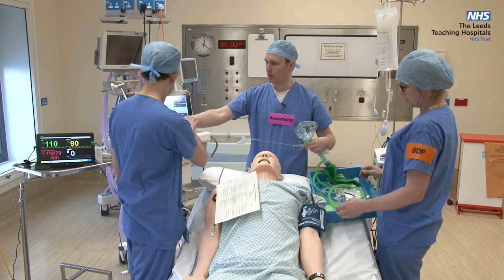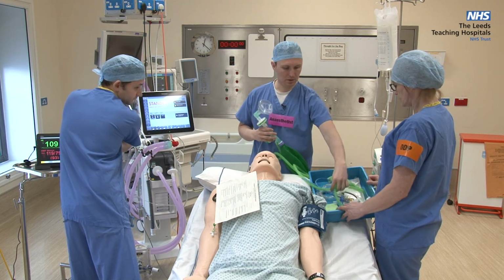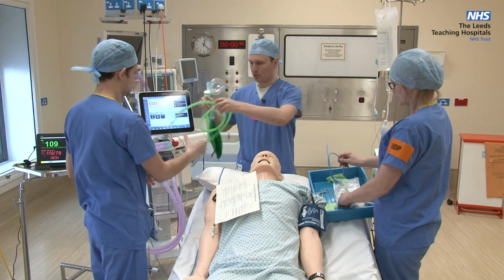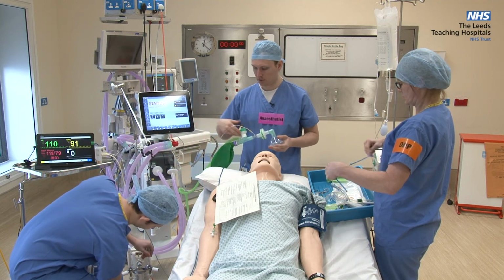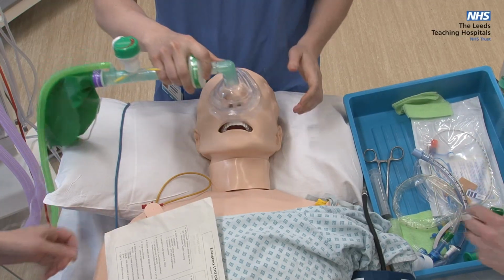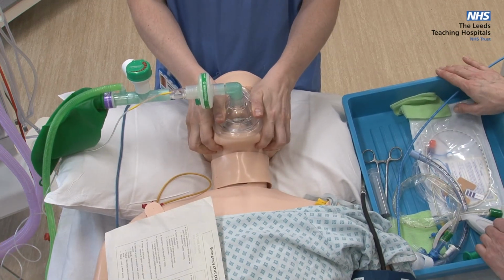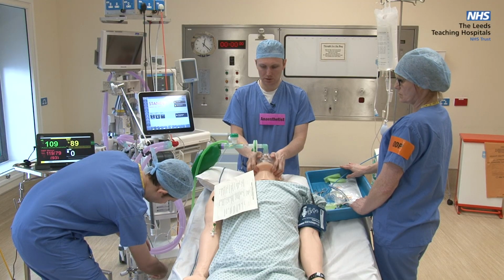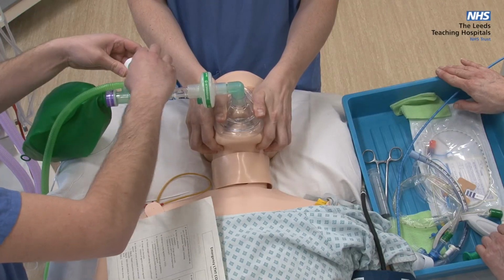So can you apply the capnography, please? Okay, capnography being attached. Thank you. And connect the oxygen to the oxygen supply. Okay, are you ready? And we shall commence oxygenation. Okay. So I have a seal. Oxygen supply on, 15 litres, and I'm going to close the APL valve.